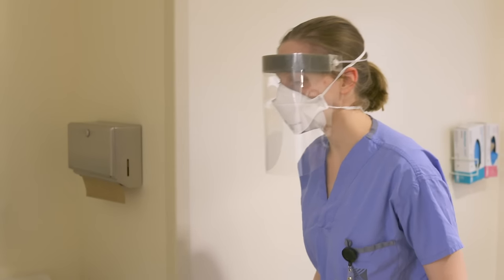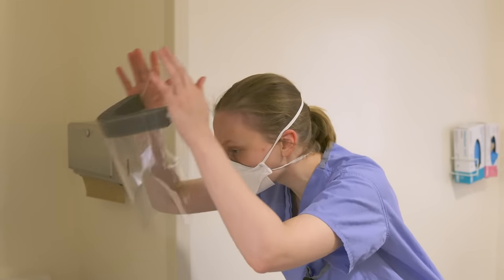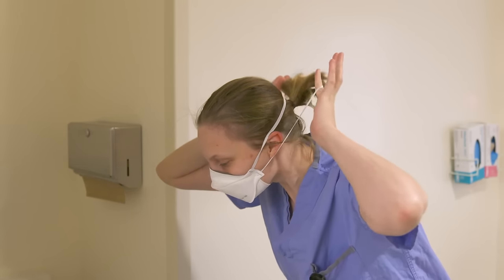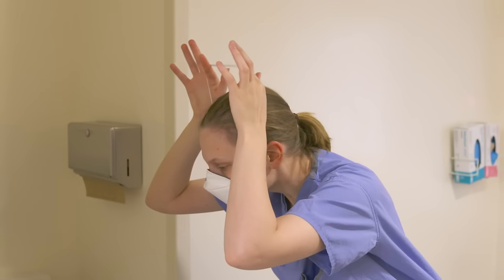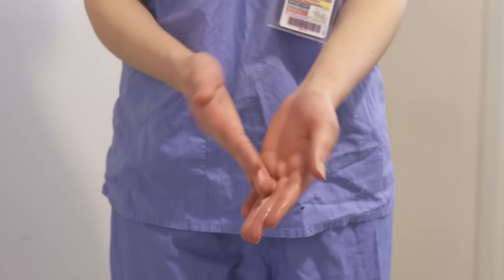Remove the face shield by leaning forward, pulling the strap forward and away from you. Place into the garbage. Remove the N95 mask without touching the exterior part of the mask. Pull it forward and away from you by starting with the bottom strap and then the top. Place it into the garbage. Perform hand hygiene again.